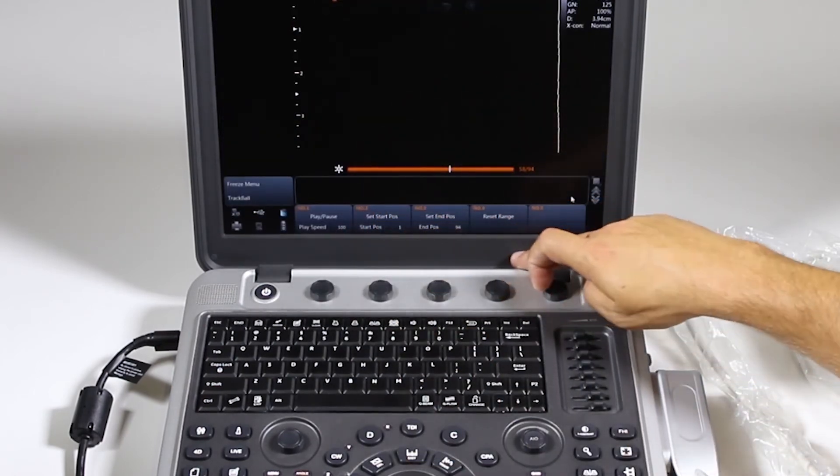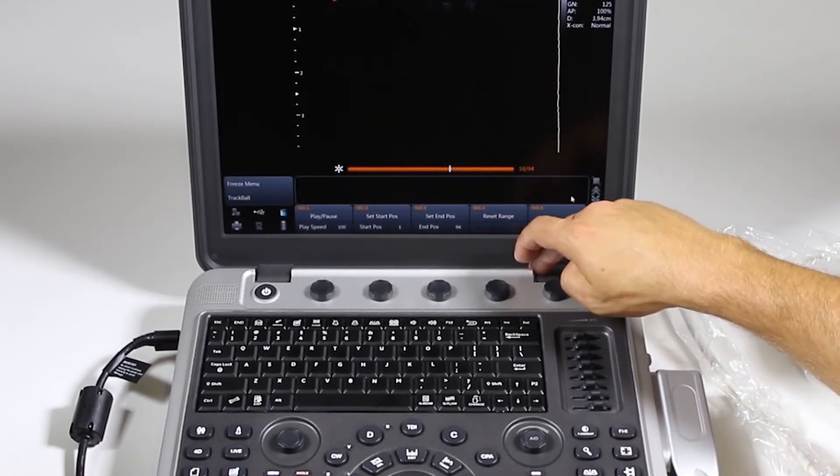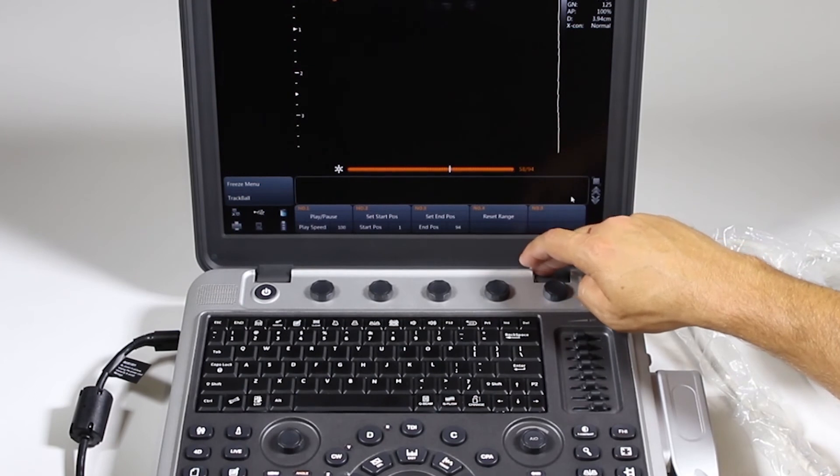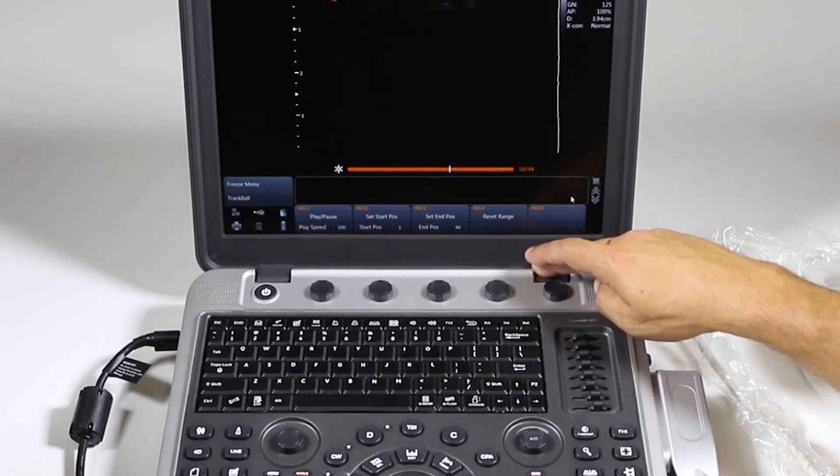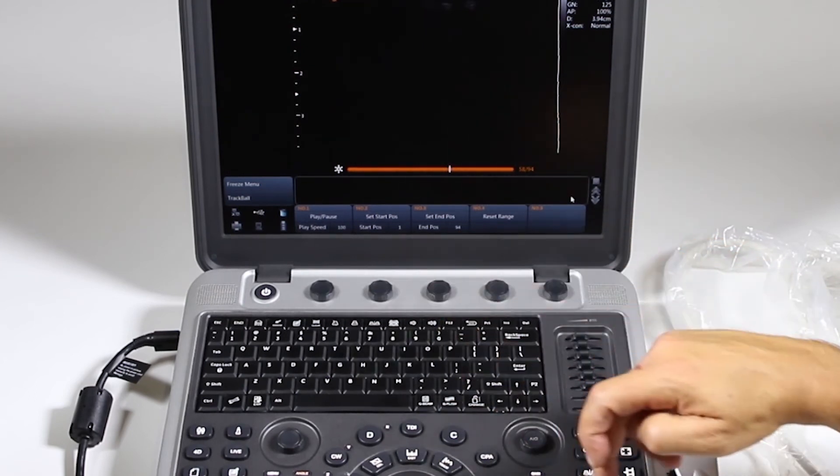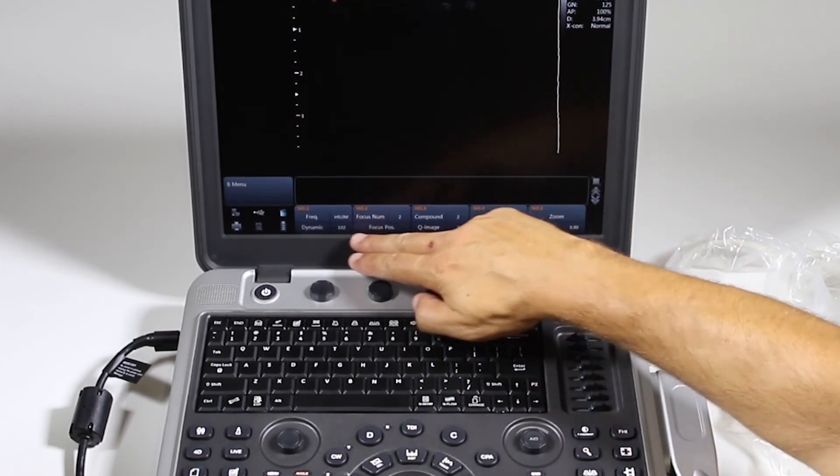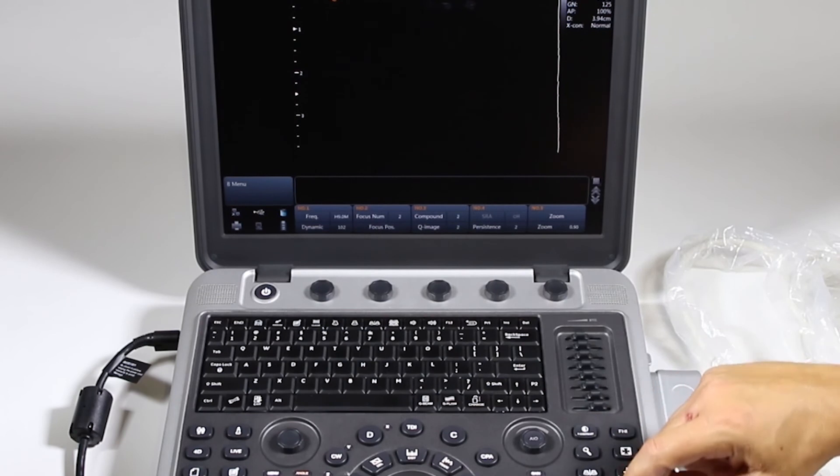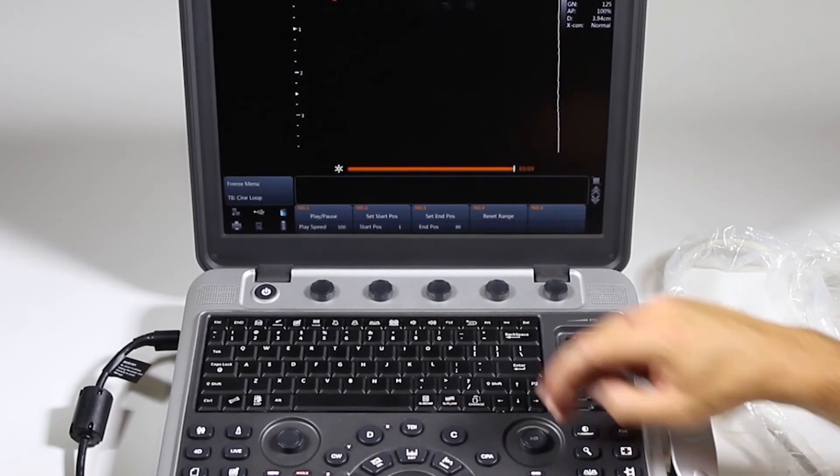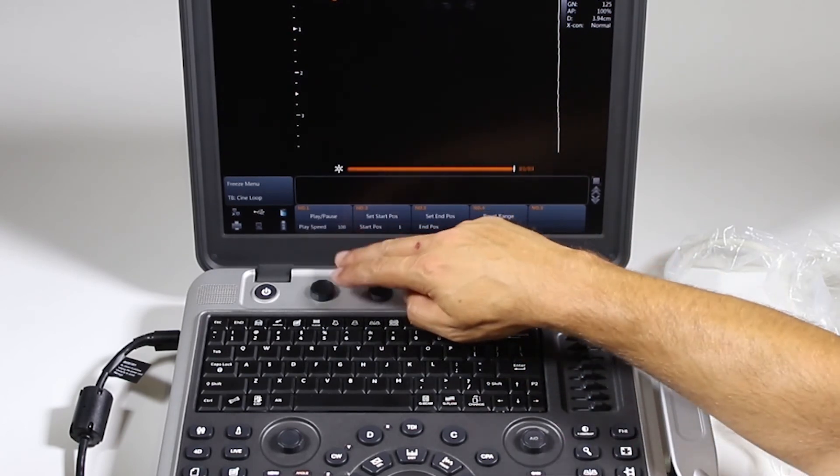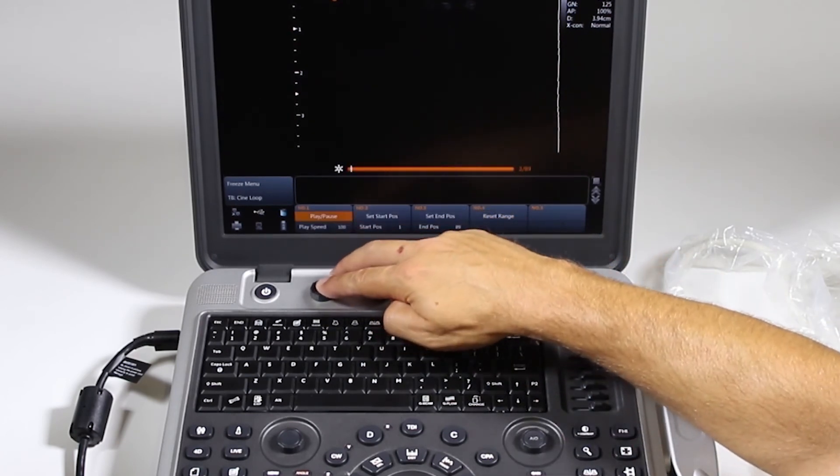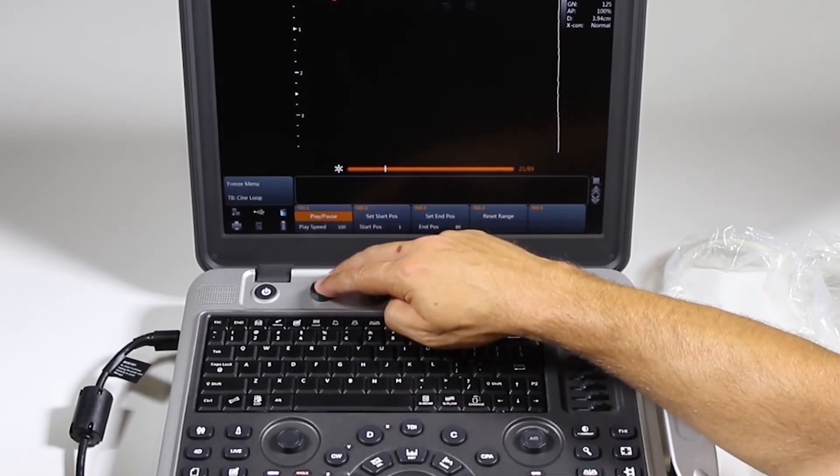Along the bottom here, we have something called soft keys, and I'll refer to these a lot during training. These things change each thing that you go into. So when I freeze, it automatically goes to my Cine menu where I can play. I can change the speed of that.